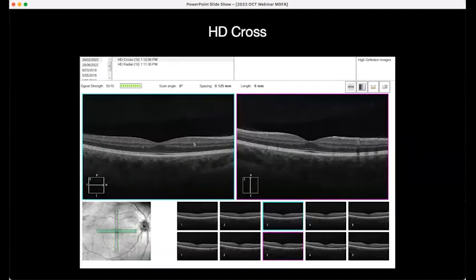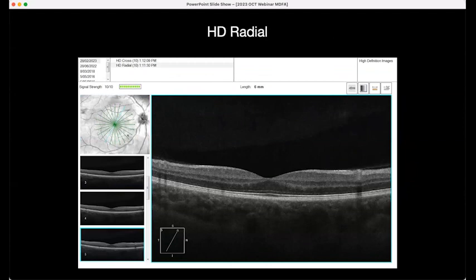The HD cross scan provides both horizontal and vertical six-millimetre rasters simultaneously. The radial scan is quite popular — a very good way of getting six-millimetre scans at all different axes, and you can scroll through or click on individual angles.